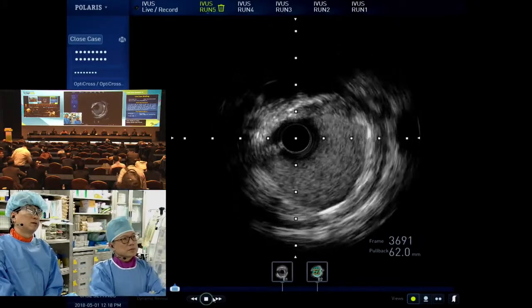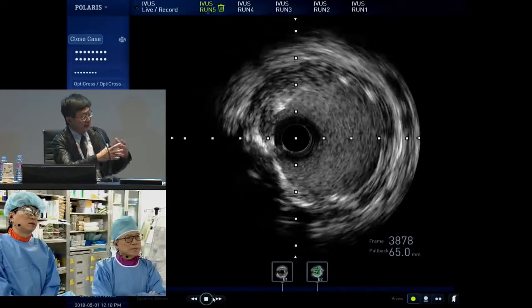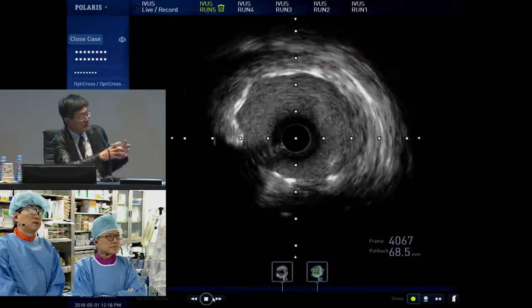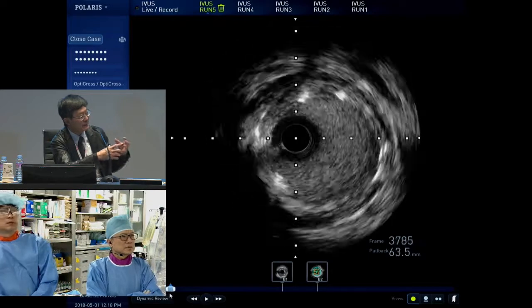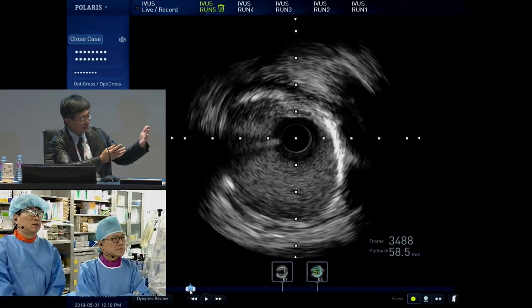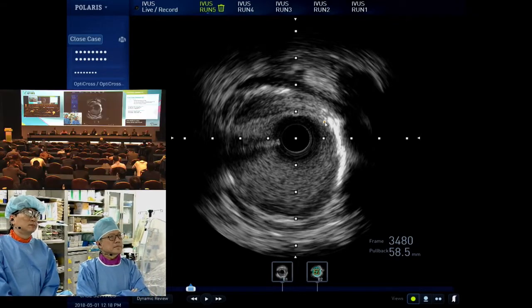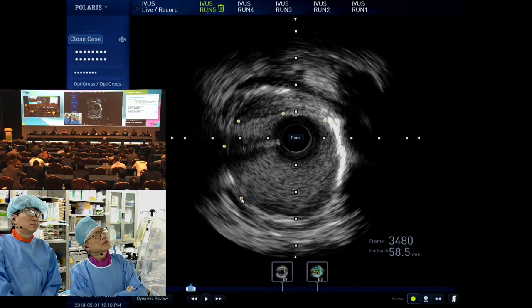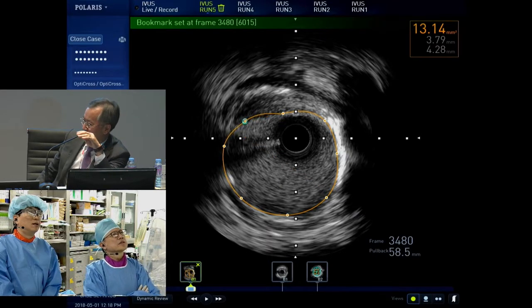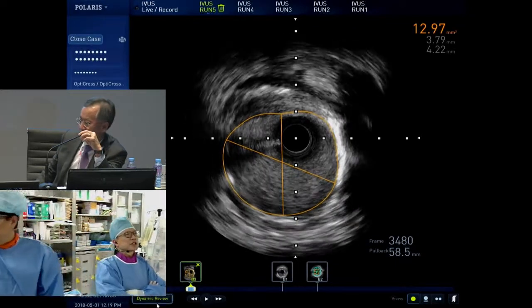One question regarding the apposition: OCT can definitely see more clearly than IVUS, but the clinical results from head-to-head comparisons and some other studies don't show such clinical relevance using OCT to detect some malapposition. For this case, in the left main, I guess there was some mild malapposition if you use OCT. But what about the clinical relevance? There is no clear evidence-based statement that OCT is better. In recent studies, as you know, they showed equivalent results. So other than some additional information, either should be fine.